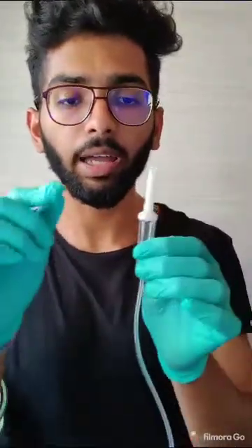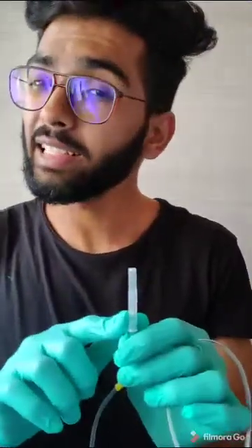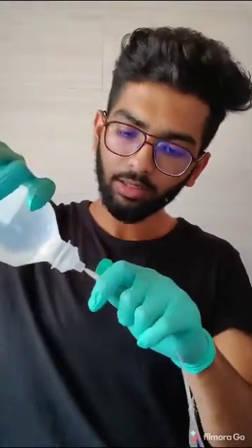First, let me describe all the parts of the infusion set. I have the spike, chamber, filter, then we have the regulator, then this is the needle. Ideally, this is a 21G needle. So we will uncap the spike part of the infusion set. We'll insert it like this.